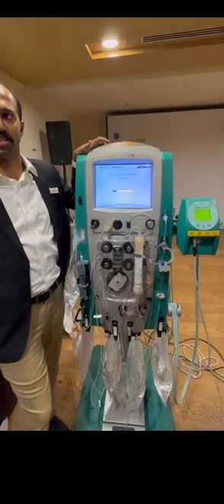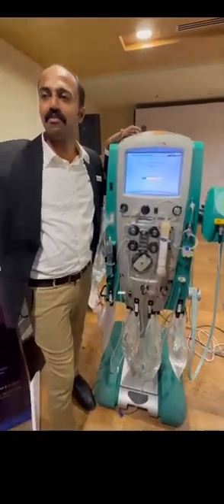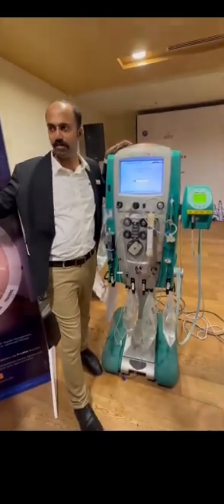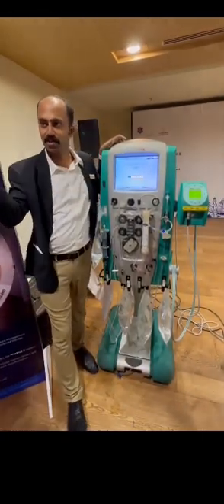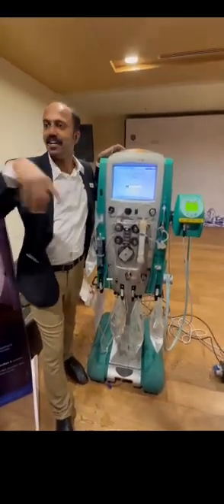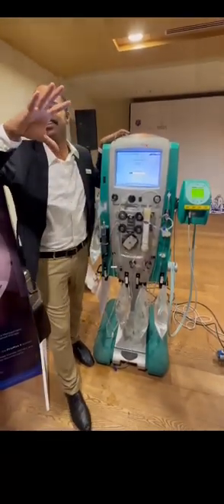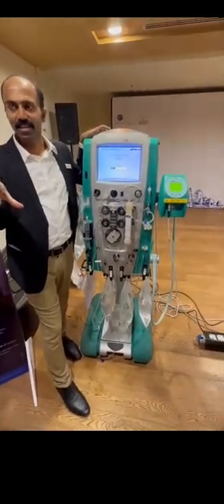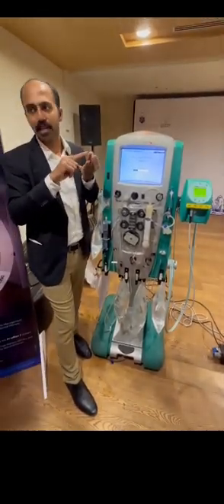the difference in the potassium. In your hospital, in dialysis, maybe you have 50 bags of 0 potassium, 50 bags of 2 potassium, 50 bags of 4 milliequivalent potassium. Staff may use 2 or may use 4. In the consumption in the system, they may put 0. The 2 will not be there, but in the system 2 will show. It is difficult for them to manage because they look almost the same. So that is one reason. But if it is 0, we can make it 2 milliequivalent, or add 3 milliequivalent, we can make it.